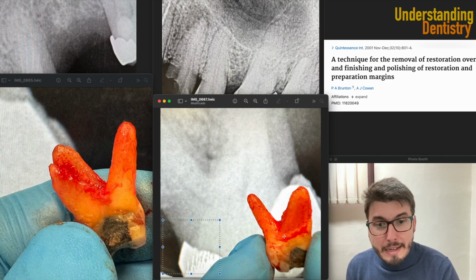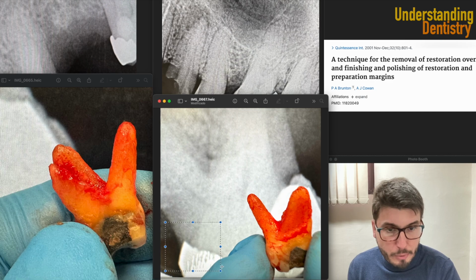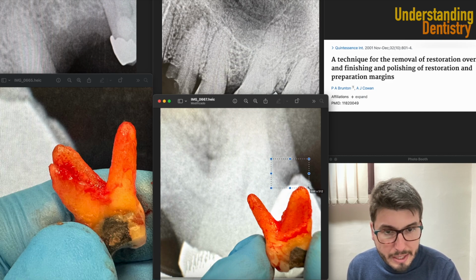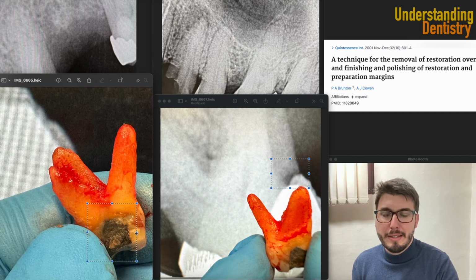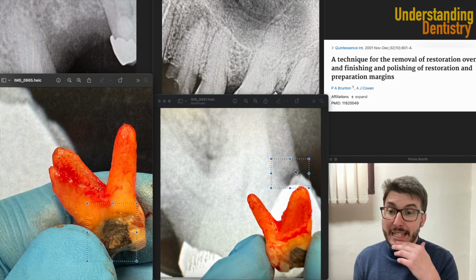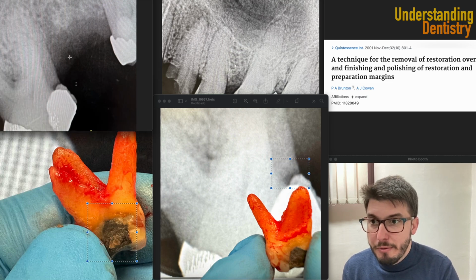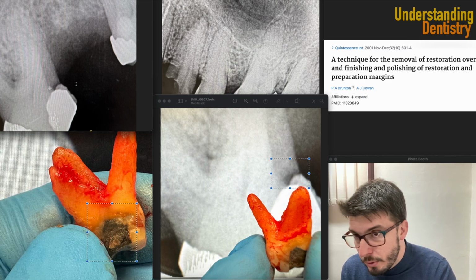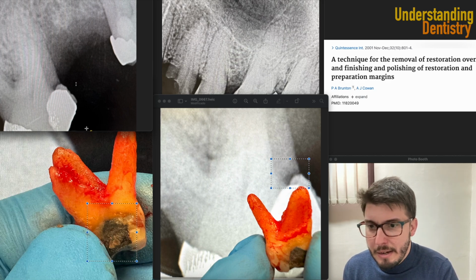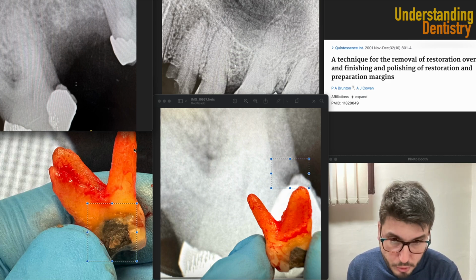And that's why we are seeing this situation on the clinical aspect of the tooth. So this is actually this, without recurrent caries. And this one here, of course, is this one here. Those are the two same surfaces. That's the mesial surface of this molar. We can even confirm it because of this radiograph, because the palatal root is aligned with the mesial root in this case, and that's the recurrent caries, and this is the surface closer to the palatal root, of course.